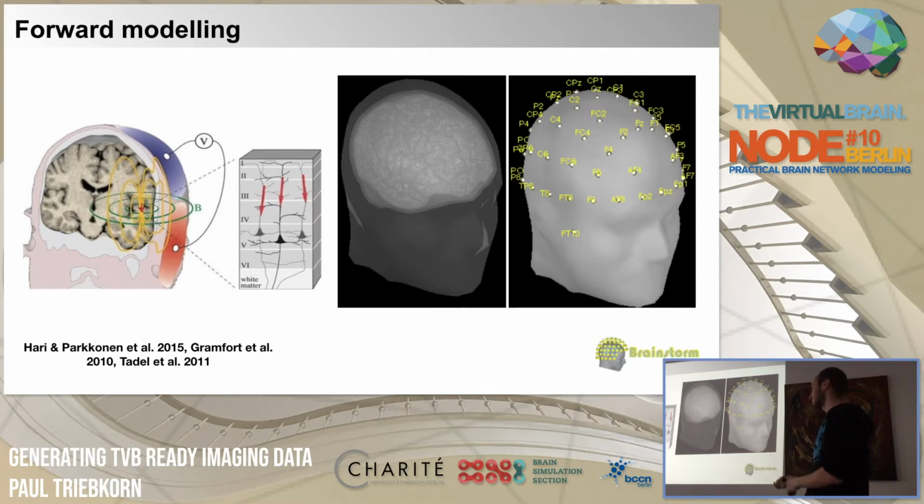And well, this is basically the lead field matrix, which I announced in the beginning, like a table or matrix where you have rows which correspond to the EEG sensors, and columns, one for each dipole on the brain. Each vertex on the surface would be one dipole. Now for region-based simulations, we just group them together, average them, and use this for projecting the neural activity which happens on the region level onto the EEG sensors on the sensor level.